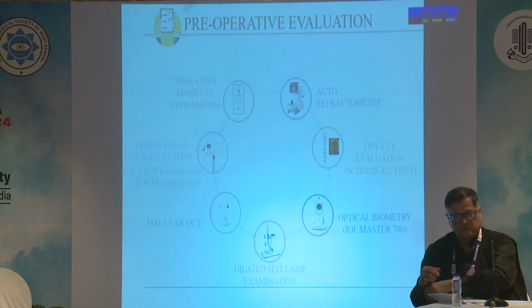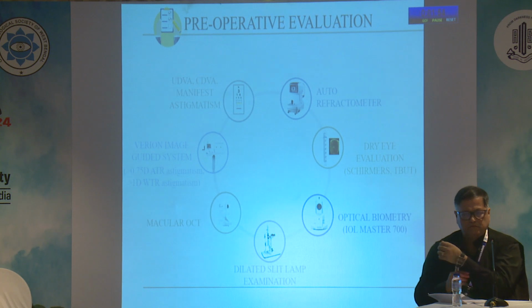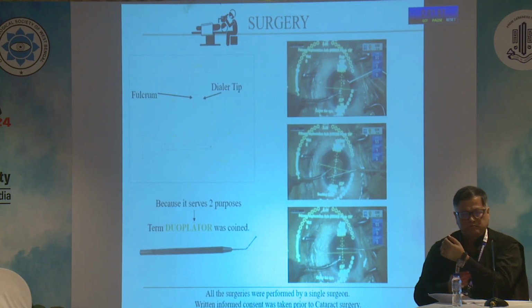Now, the preoperative evaluation included the routine cataract evaluation, what we do for all our patients. Now, because I couldn't put the video as this was a poster podium presentation, I will just show you how the instrument looks like later after the presentation. So this has a fulcrum here, which helps to push the iris, and then there is this dialer tip which helps in dialing the IOL to its desired axis.